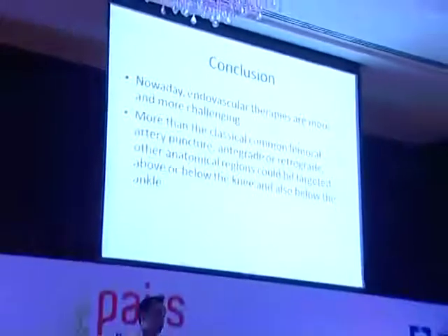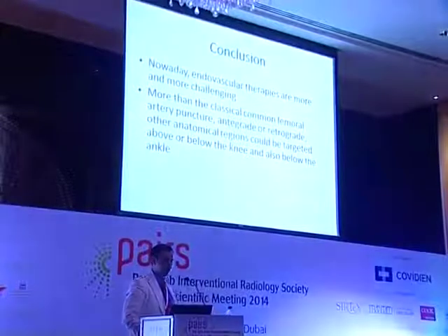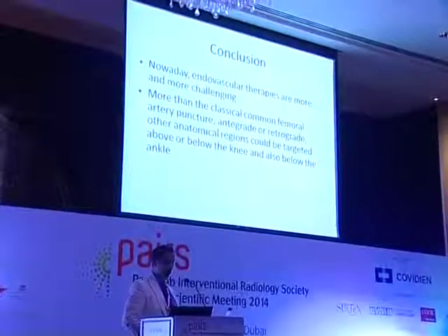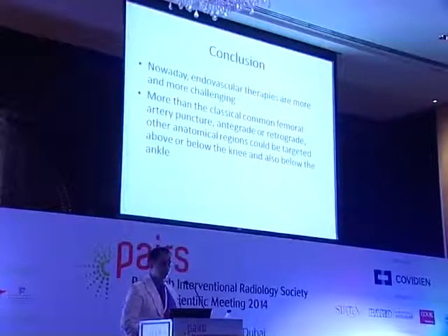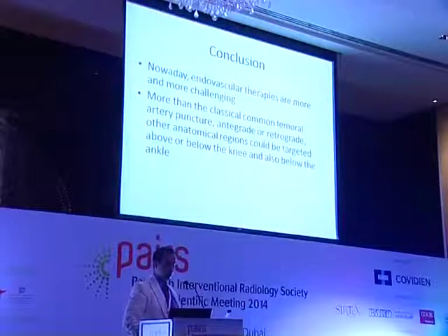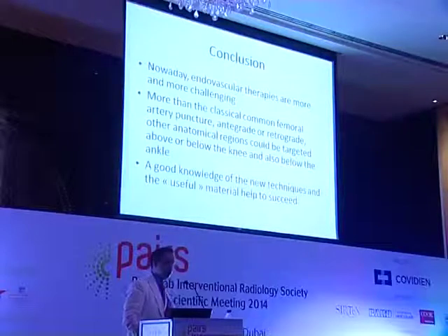And in conclusion, I would like to say that it's important to know the material. Nowadays, endovascular therapies are more and more challenging. More than the common femoral artery puncture, antegrade or retrograde, we can also use other anatomical access to improve the result of our recanalization. And thank you for your attention.